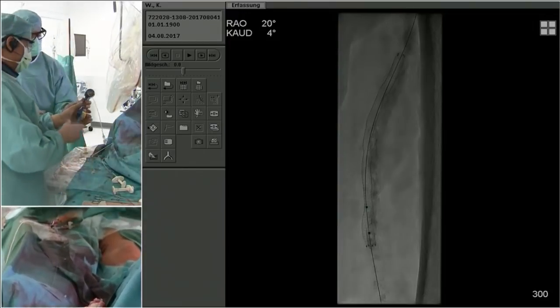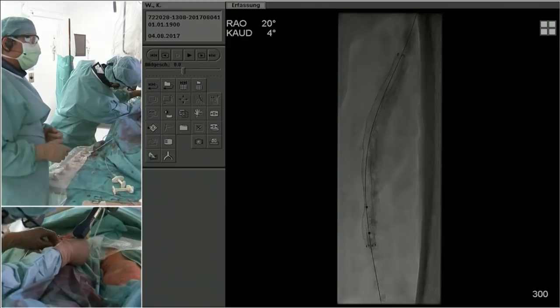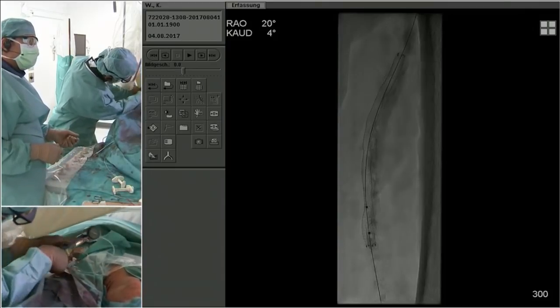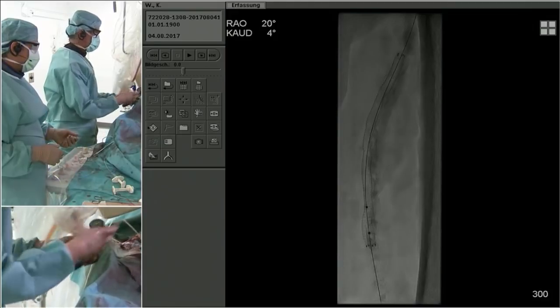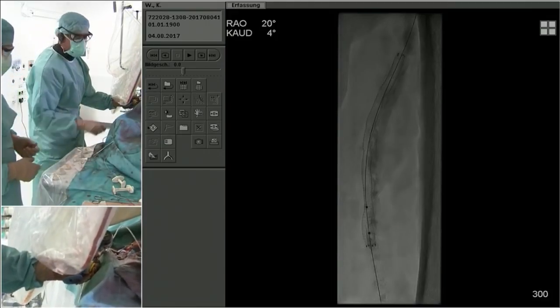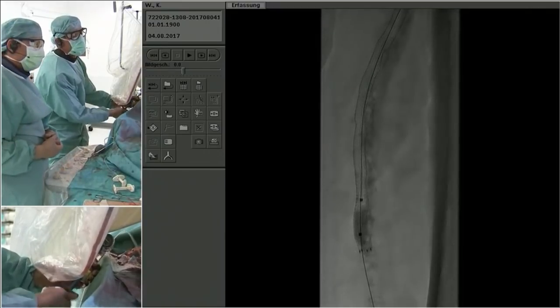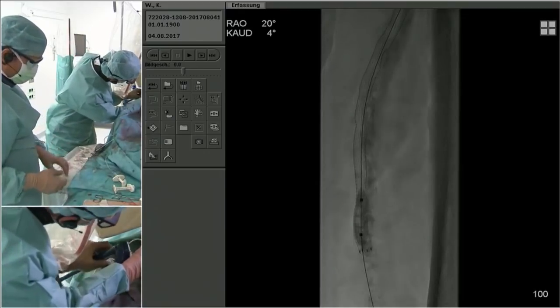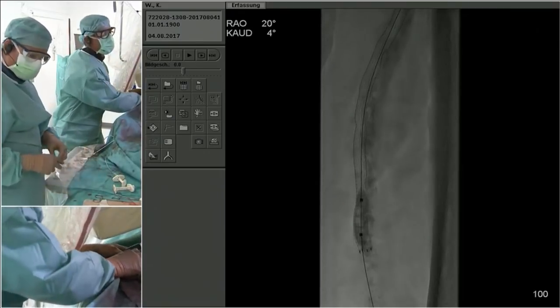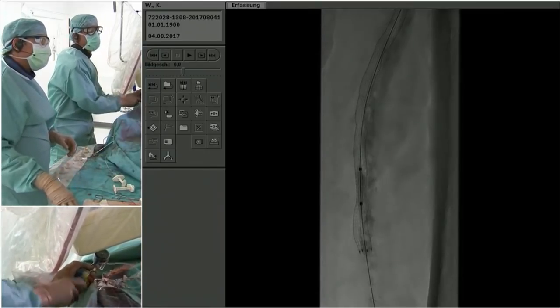Yeah. My experience has been that when you focally force dilate inside the Viabahn, you actually get pretty good effacement. I mean, we're learning. I'm always learning from Andrej, but we have not done the Supera inside the Viabahn. It's ingenious, but having not done that, we found that we can open it up with a short balloon, for the most part. Anyone on the panel, starting from Christian and Ehrin and Ian, would now still go with the Supera? Andrej has an excellent question for us.